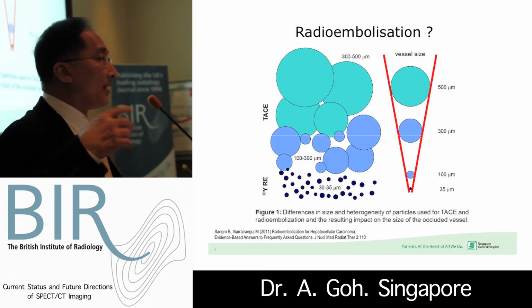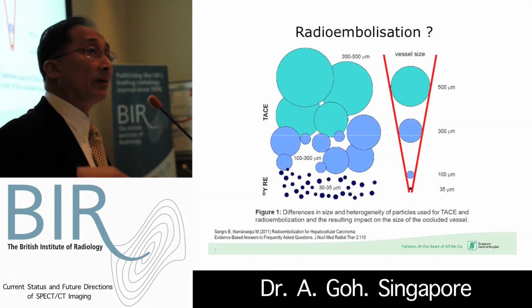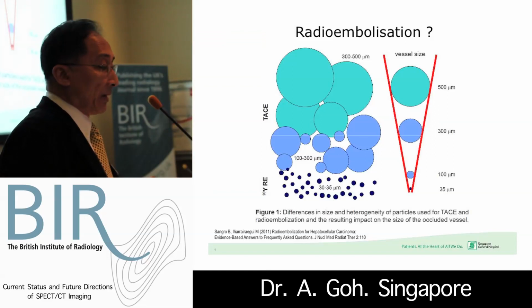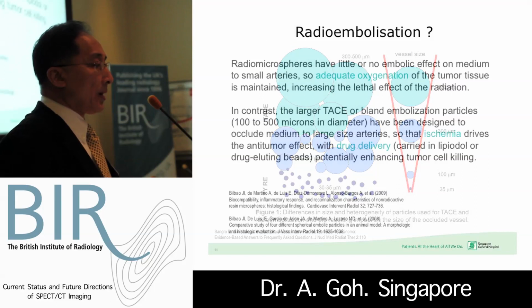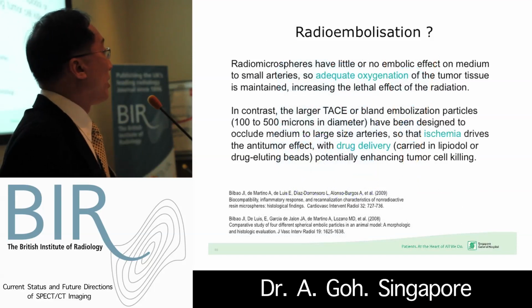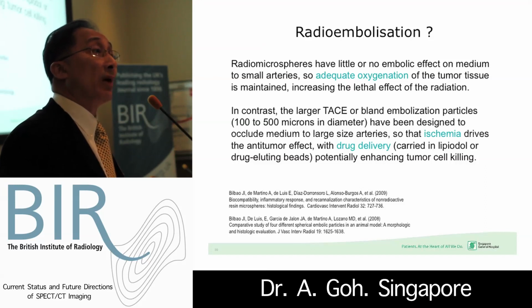and well, globally the accepted term is radioembolisation. That's because it has been driven a lot by interventional radiology. But in actual effect, yttrium microspheres are a lot smaller compared to the large particles used in arterial chemoembolization. And we know from our understanding of radiobiology that radio resistance is associated with tissue hypoxia.